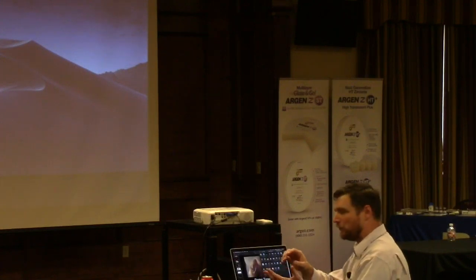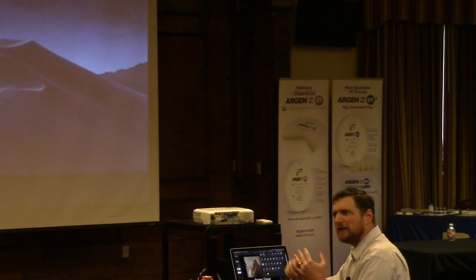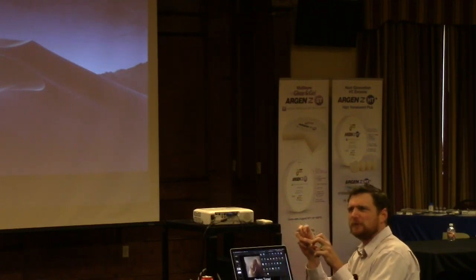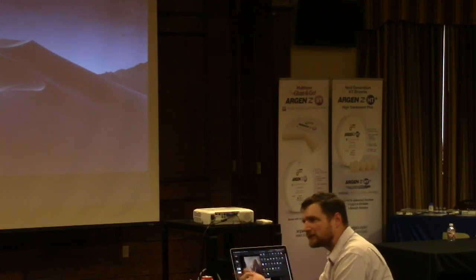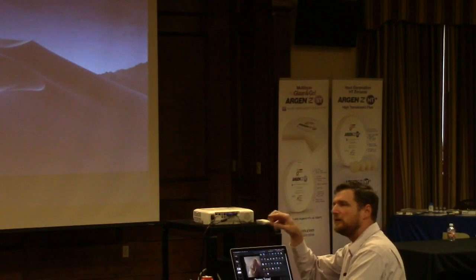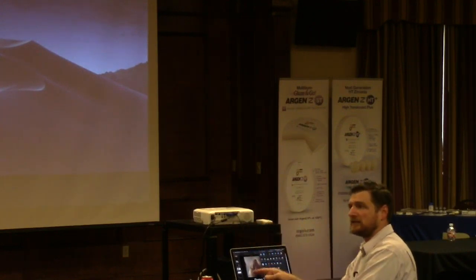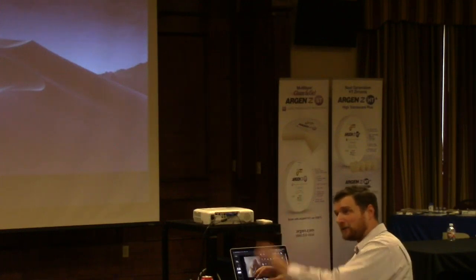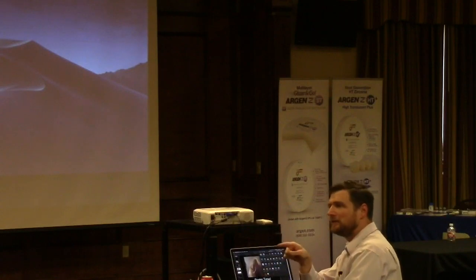One thing I like, there's 3Shape, that you have to become a lab partner with. You don't have to do it if you have EasyRx, because they can tell the 3Shape people on the 3Shape scanner how to export the STL and put it in a file, and it runs a little program and puts it into EasyRx. So there's a workaround. Same thing with iTero.